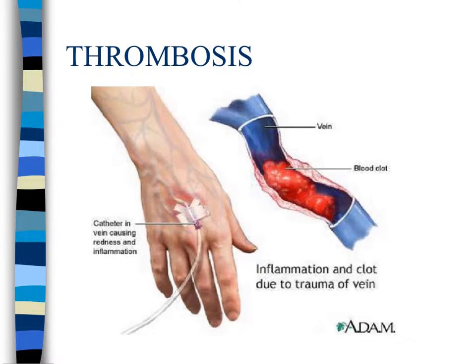Prevention of thrombosis includes using pumps and controllers for managing rate control. Rate control devices prevent blood from backing up in the tubing and produce an alarm when the IV line is dry. Choose microdrip sets with gravity flow if rate is below 50 cc's an hour. More drops means more movement. Avoid flexion areas such as the inner antecubital area of the arm. Use filters and use proper venipuncture techniques to reduce injury to the vein.